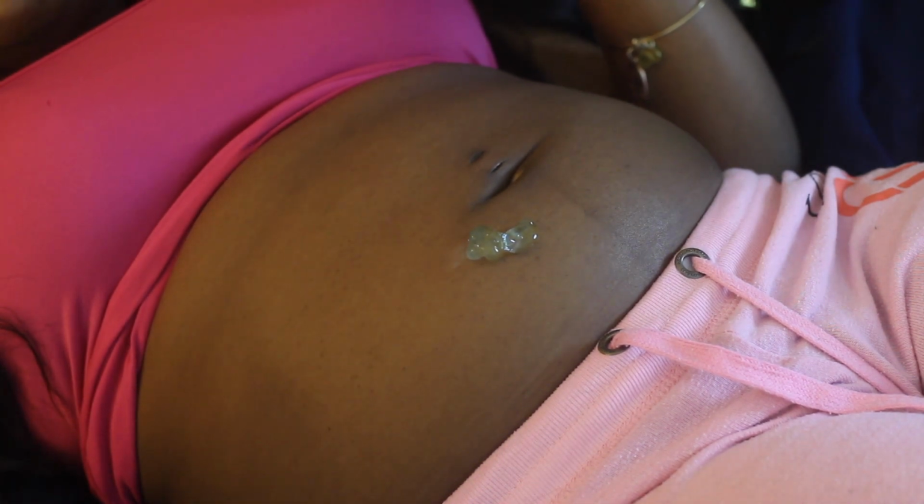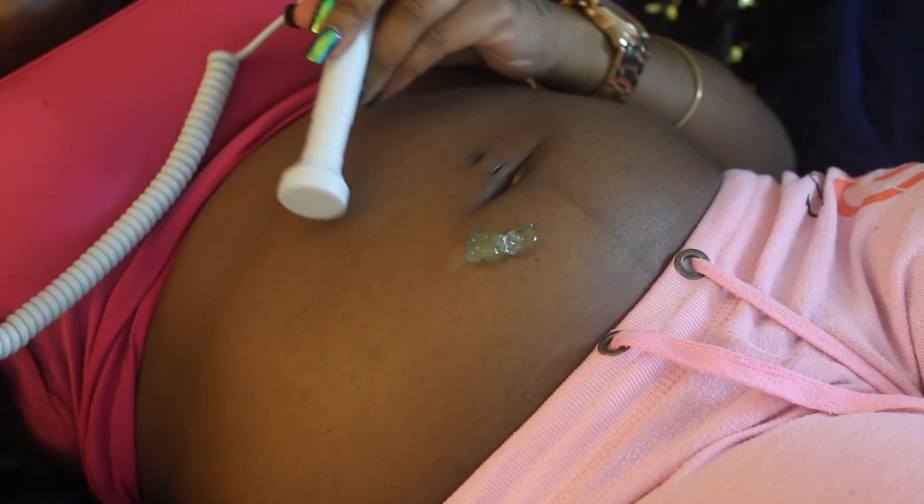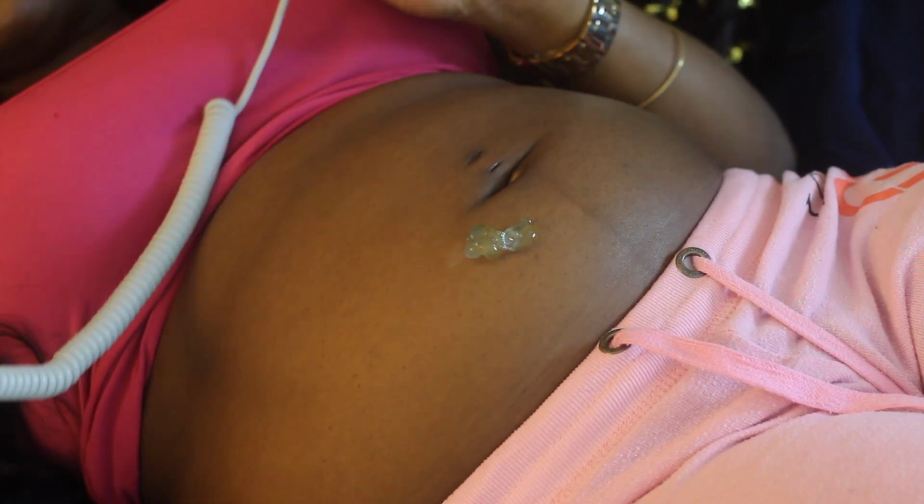Before you even start using this thing, you want to make sure you know the different noises. The placenta makes noises, your heartbeat makes a noise, obviously, and baby's heartbeat is clearly like a galloping horse noise. I've seen people on videos who think the swooshing noise is the baby's heartbeat. That's why a lot of OBs don't like people to use these, because it can give you a false sense of security and you hearing the wrong noises in your stomach. So I would just say, when you go to your 4-week checkups, look at how they're moving this thing and listen to the noises. And then YouTube the noises. That's how I knew exactly what my baby's heartbeat sounded like, because I YouTubed the noises.